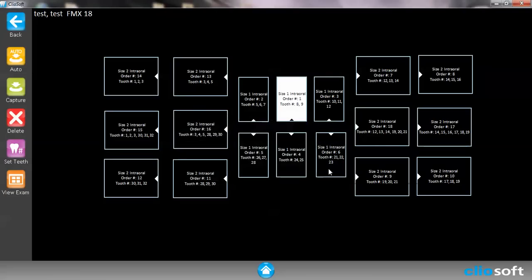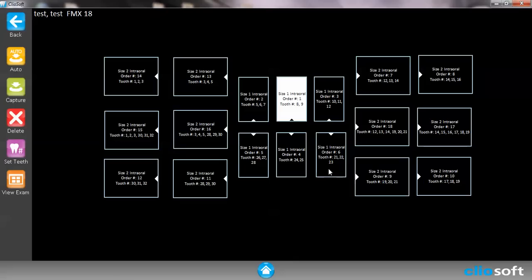Now once you're in the FMX all you have to do is plug in the ClioSoft sensors. They are direct USB. There is no on and off button for that. It is a live sensor. So as soon as you plug in the sensor it is live and ready to take images.